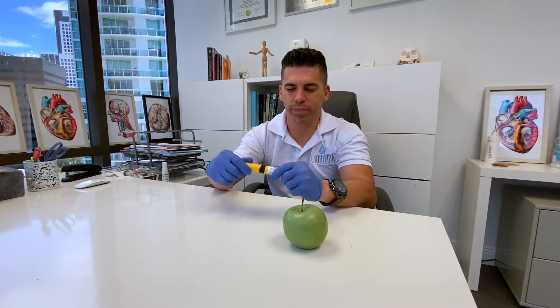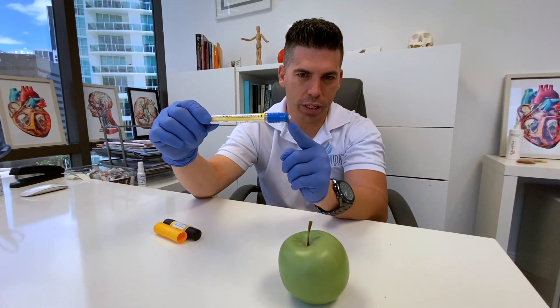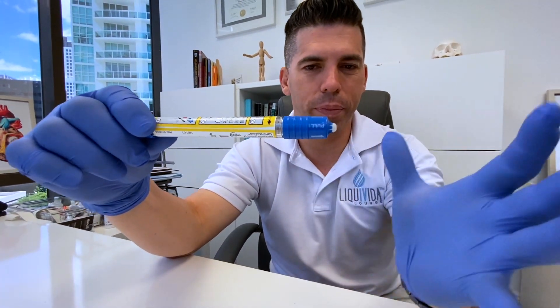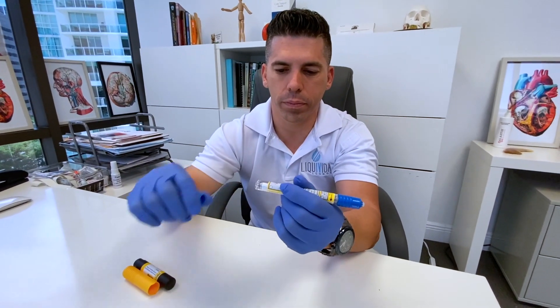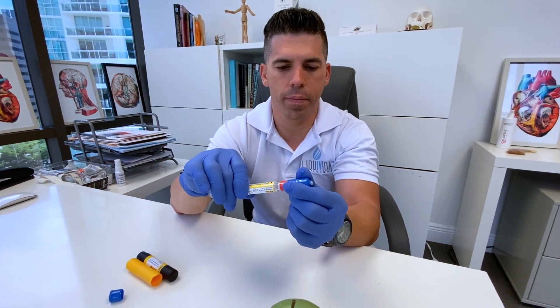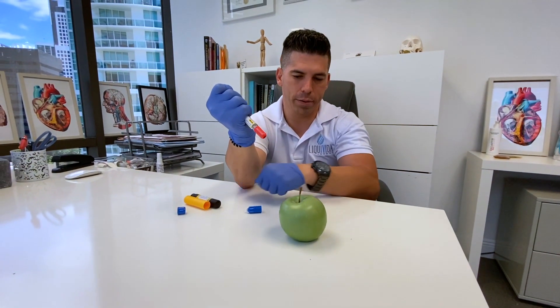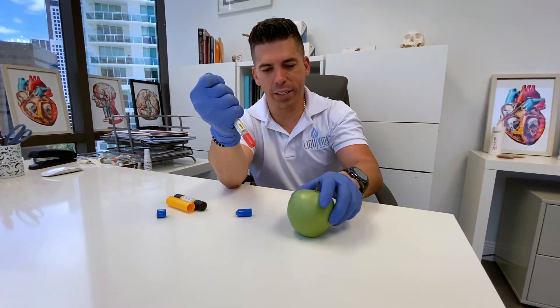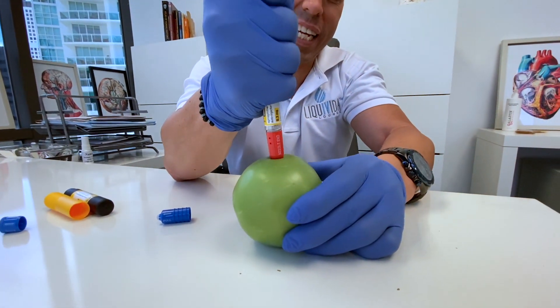We're going to twist the top off very carefully — these things can fly out, so you want to be careful. The needle is going to come out right through here, so you don't want to be manipulating that with your hand. Pull off the top cap like that. The needle is on the other side, right where it says 'needle.' Hold it like that, pretend this is your leg, go in, push in hard, and hold it for 10 seconds.